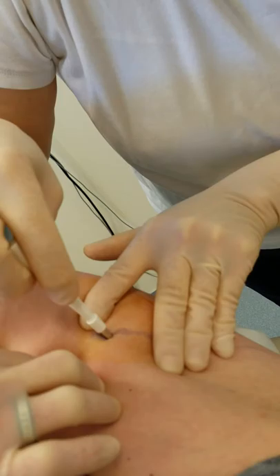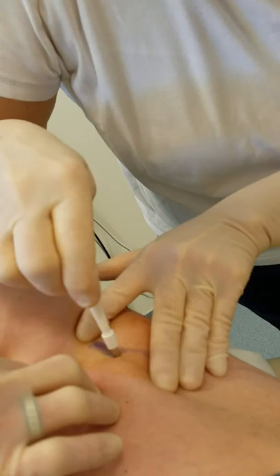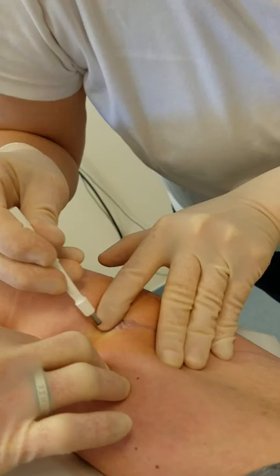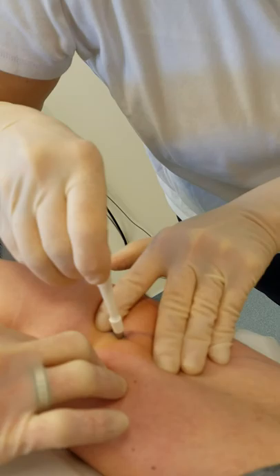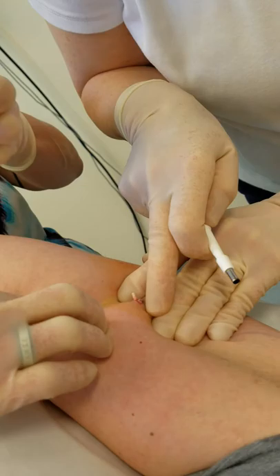The skin here is very soft, so keeping in touch with where that Nexplanon is, we're just putting this punch in around the tip. A little bit of tenderness. The Nexplanon is going to want to come right up into the punch. There we go — you can feel it right there and as we take it off, see, it's right there.